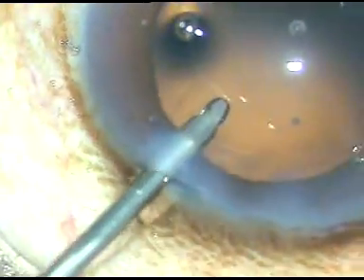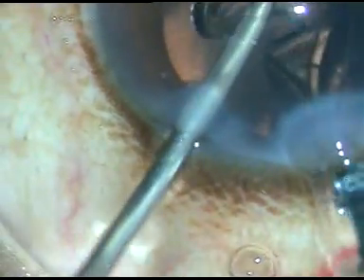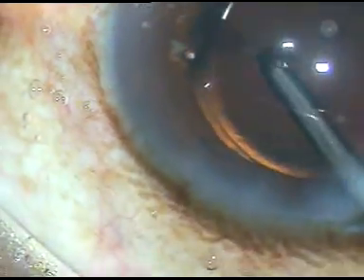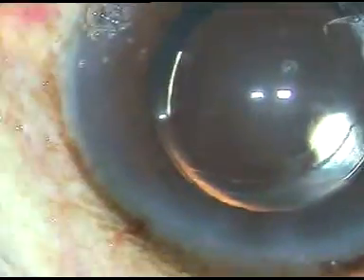Now this is a hydrophilic acrylic intraocular lens being implanted in the capsular bag. The irrigating probe helps the trailing haptic to go into the capsular bag.